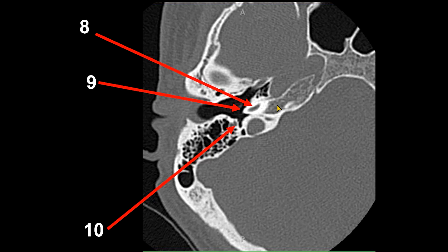Number eight is the basal turn of the cochlea, and number nine represents the small bony hillock overlying the cochlear basal turn — that is the cochlear promontory. Number ten points to the descending portion of the facial nerve.